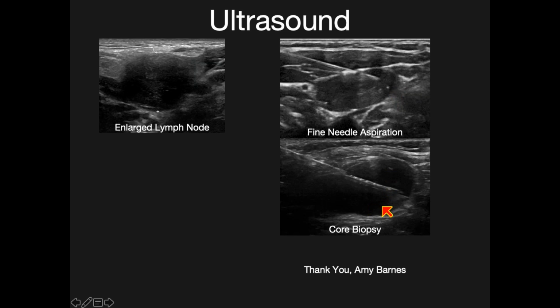Sometimes we want a slightly bigger sample. In this patient with suspected lymphoma, we would perform a core biopsy, and you can see the whole length of the needle within the gland itself. And I have to thank my colleague Amy Barnes for these lovely images.